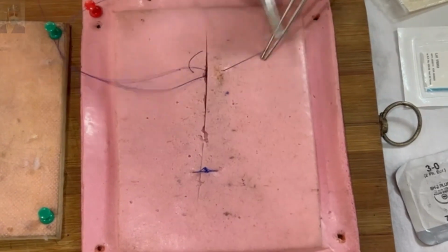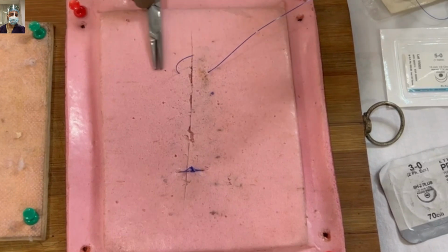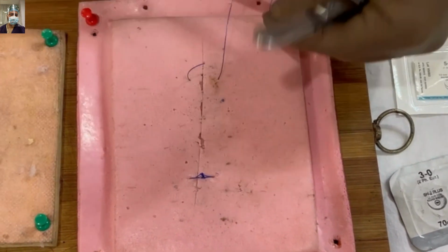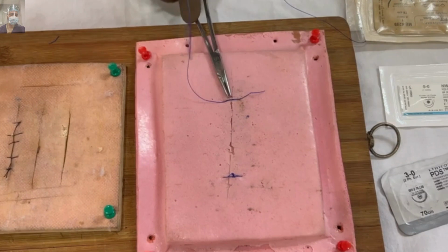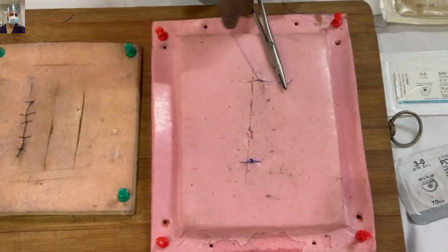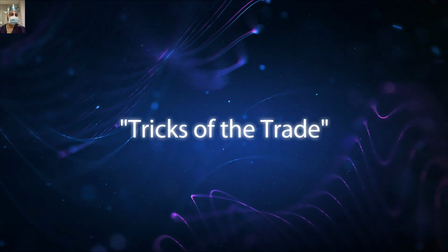So come inside the V. This is a V with a longer limb and a shorter limb. I took 2 throws. My hands will rotate, and this is a perfect surgical knot. Again, come inside the V, and then apply another throw, so that will create a perfect knot for you guys. As we progress, we will be sharing these tricks of the trade.